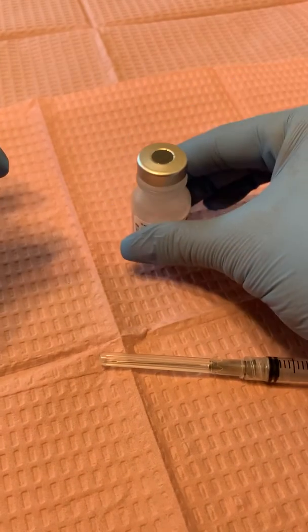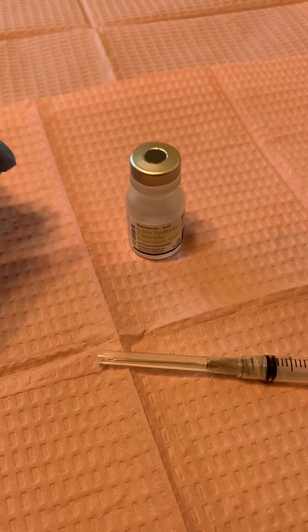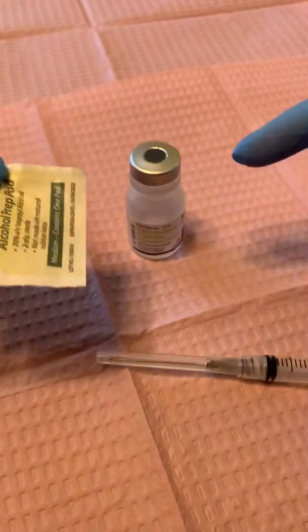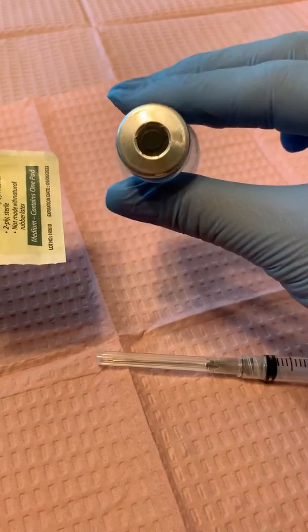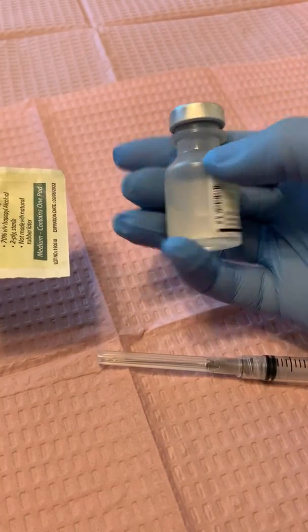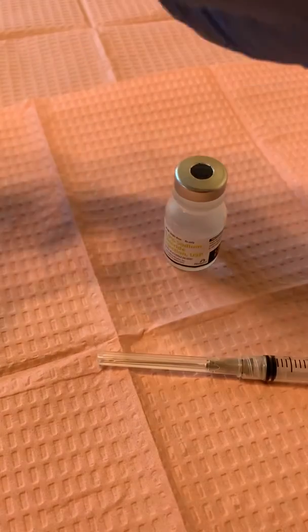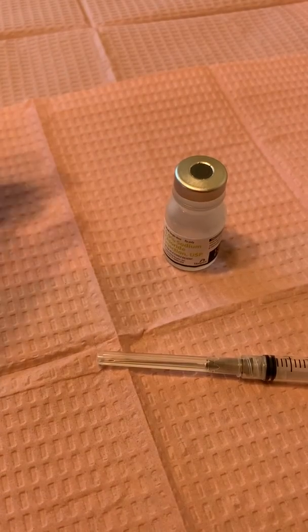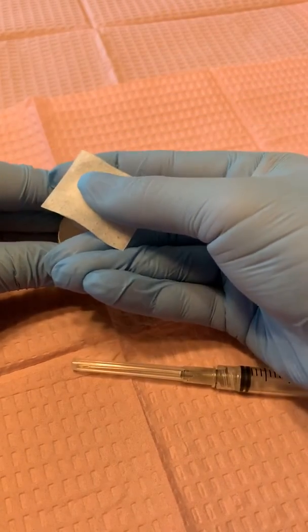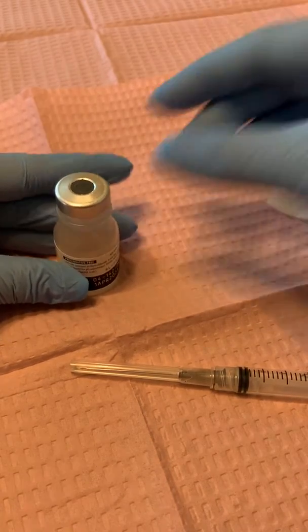Now I'm going to get my medication. We're going to simulate that it's a medication that's already ready for being drawn up. I'm going to take my alcohol pad and clean the top because, as you see, this is an open top — so it's not sterile anymore even though the contents inside is. I'm going to clean it with alcohol so I don't cross-contaminate and inoculate the vial with any bacteria. I'm just going to firmly press down and wipe it clean.